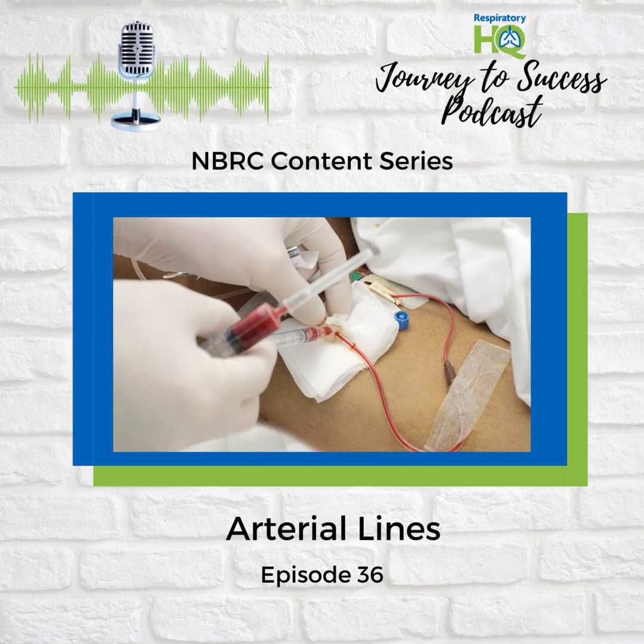Or if doctors need frequent blood gas measurements, that tells them about the oxygen and CO2 levels in the blood. I can see why that would be so important in critical care. But I bet there are some risks with having that tube directly in your artery. You're right. While it's really useful, arterial lines are not without potential complications. We should definitely talk about those. Let's do it. I'm ready.